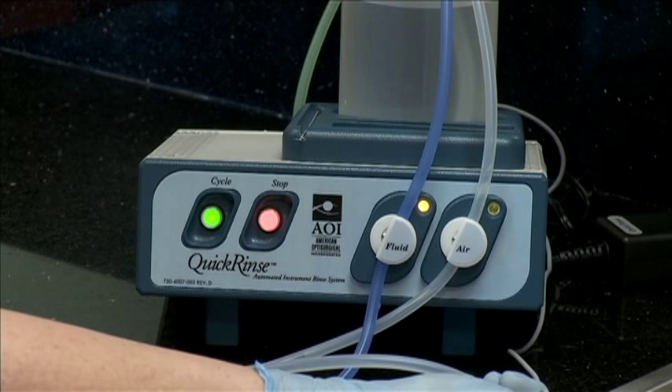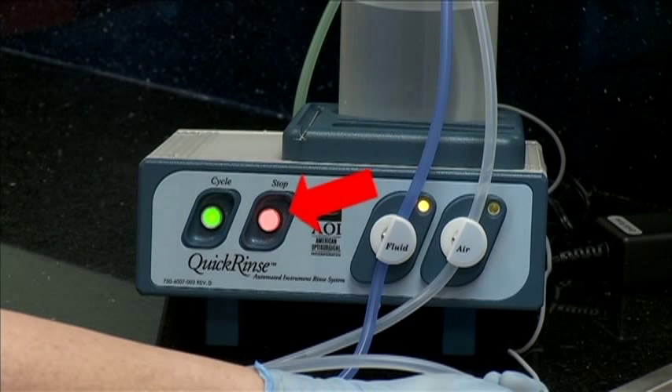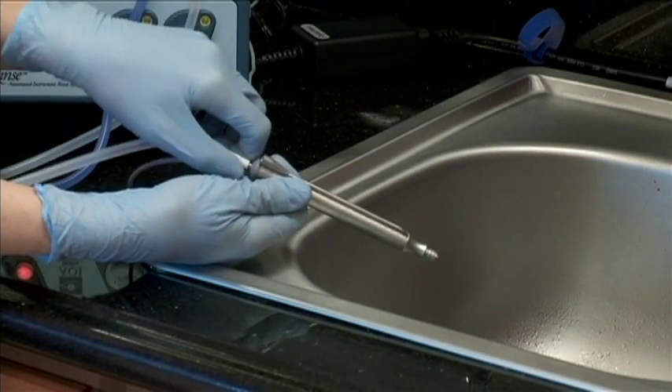The amber light above the fluid valve will light up, indicating that the valve is open. After 15 seconds, the unit will close the fluid valve and then open the air valve. The amber light above the air valve will now be illuminated. After 15 more seconds, the air valve will close and both amber lights will be turned off. You can press the stop button any time during the automatic cycle to stop the cycle, which also resets the cycle when pressing the cycle button.